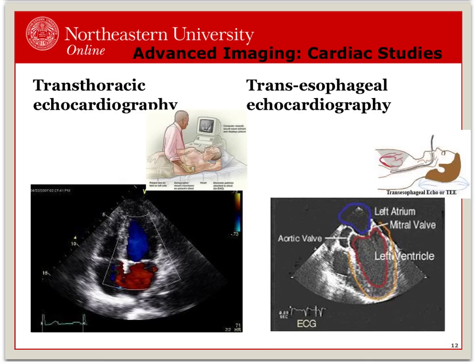Doppler imaging shows the color spectrum of blood flow both to and away from the probe, displayed in red and blue. The echo is the primary imaging study for valvular imaging. The two most common types are transthoracic echocardiography, or TTE, and transesophageal echocardiography, or TEE. Transesophageal echo is more invasive but visualizes the posterior borders of the heart. Stress tests often accompany echocardiograms.